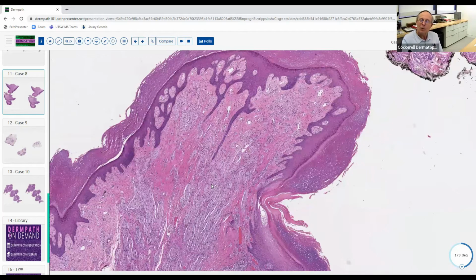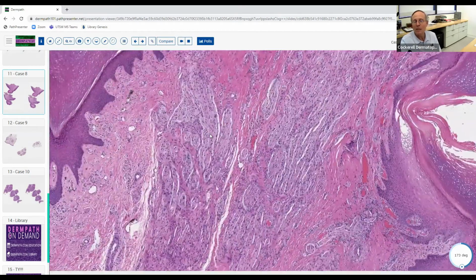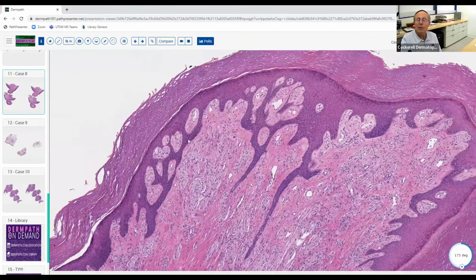That usually gives you kind of whorls of fibrous tissue surrounding little small epithelioid aggregations. And you usually see that it almost looks like a fibrous tumor. You don't usually see these nice little nerve twigs and fascicles arranged in a haphazard array here. So they're not normal nerve twigs. Some are small. They're oriented mostly vertically, but some of these up here are just sitting there on their own, and they're forming these little whorls up here.